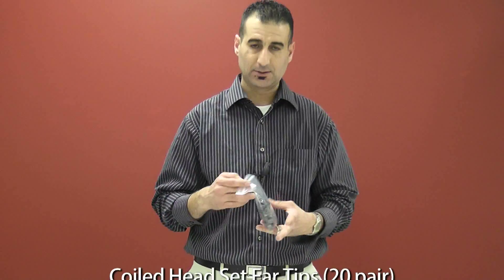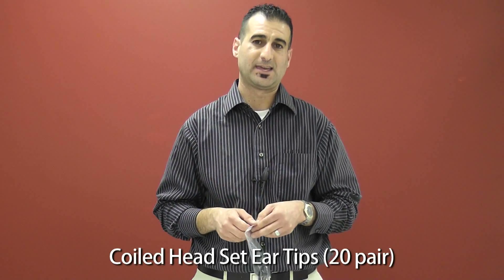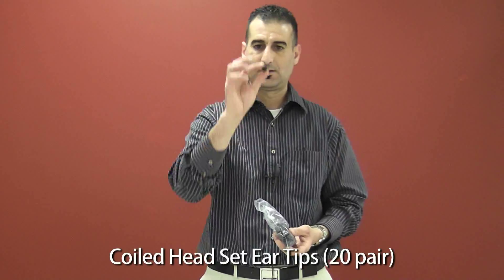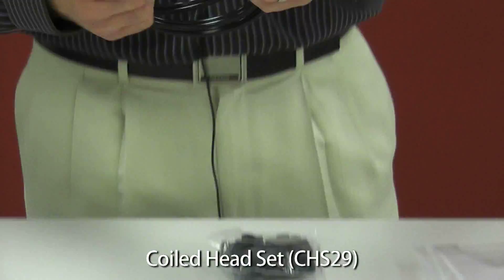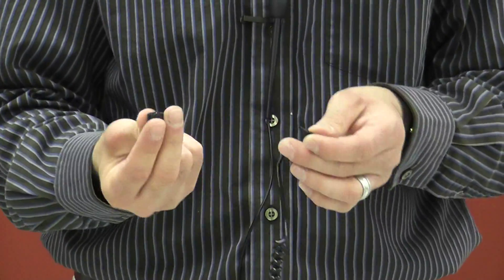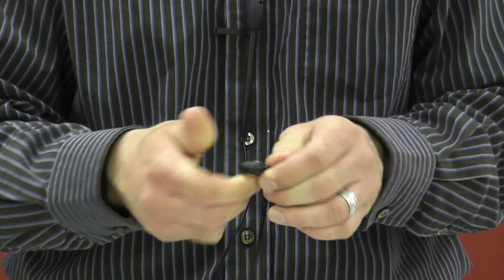Next, we have a 20 pair sample of the CHSRTs. These are the ear tips that go onto the coiled headset for the CHS29. The earplugs are placed right into the elbow.